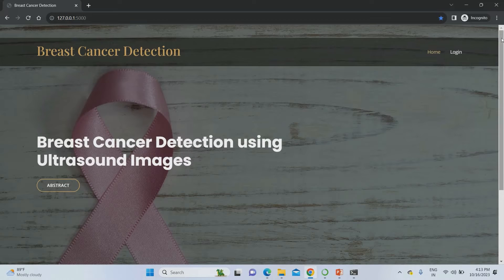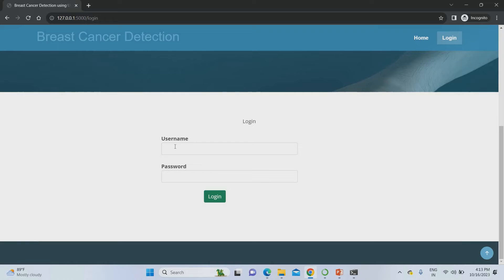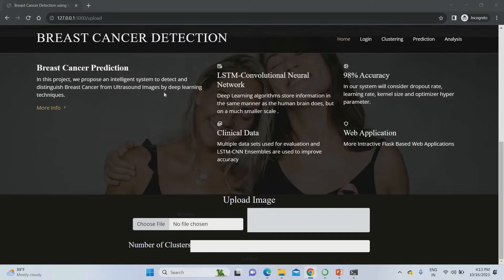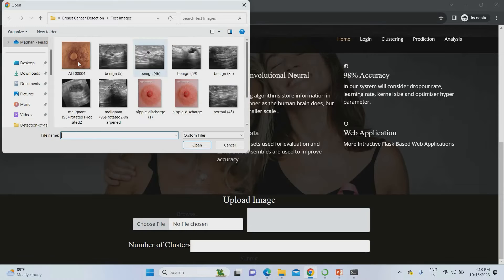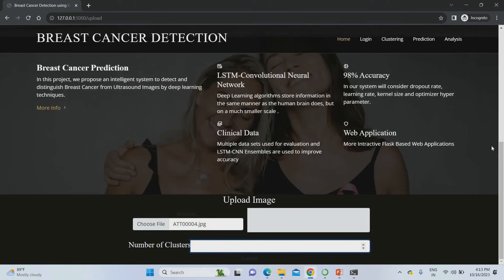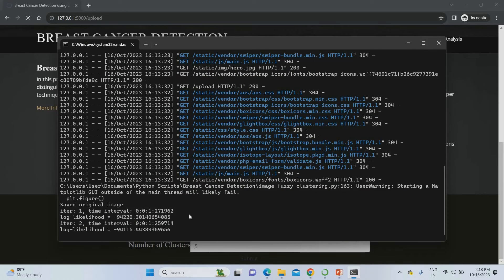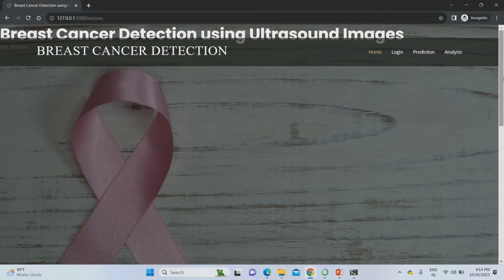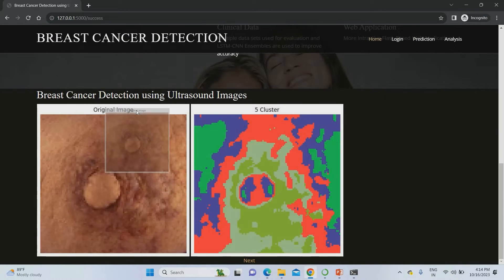The project homepage shows the abstract. After login using 'admin' as both username and password, go to the segmentation part and upload breast cancer images. I'm uploading some sample images and setting five clusters, then submitting. The segmentation process begins and proceeds through iterations. After 10 steps, the next page shows the original image you uploaded alongside the segmented result.